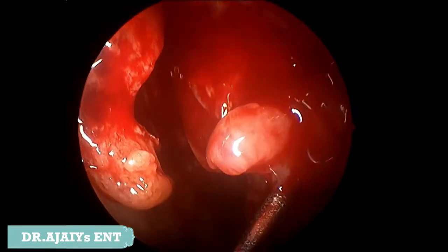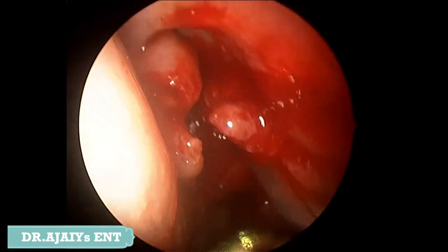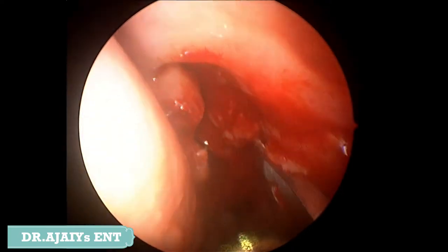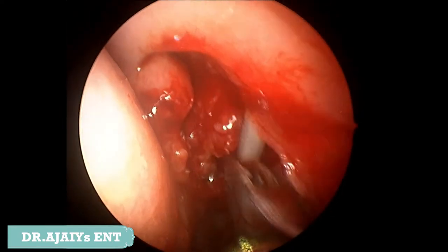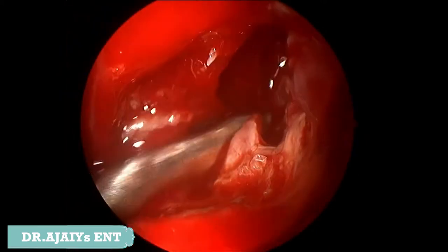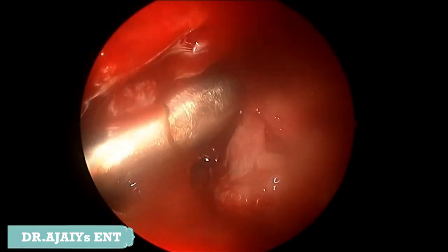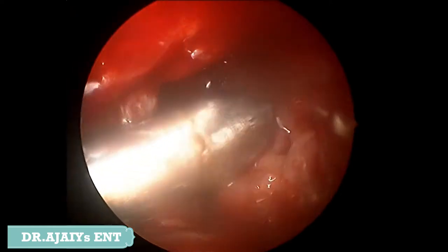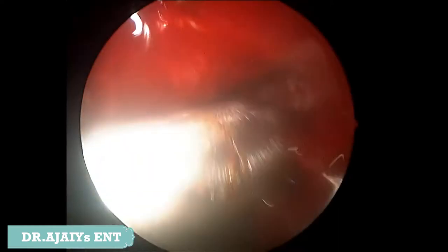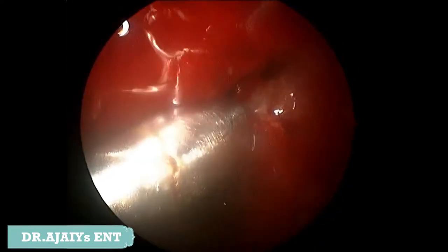Using a back biter, we removed the entire uncinate process and then did a wide middle meatal antrostomy as shown in the picture. After doing the wide middle meatal antrostomy, we did a thorough washing and could see some inflammatory polypoidal contents present within the maxillary sinus.